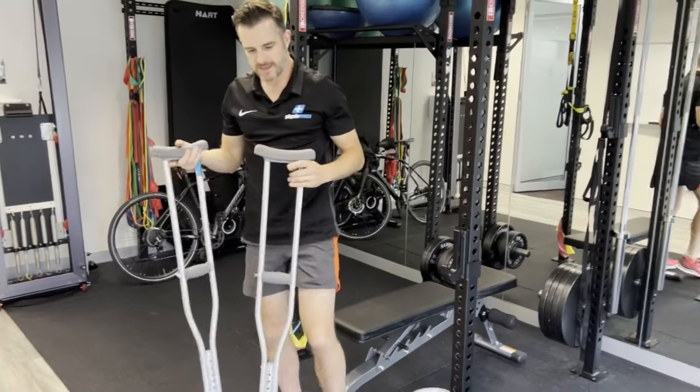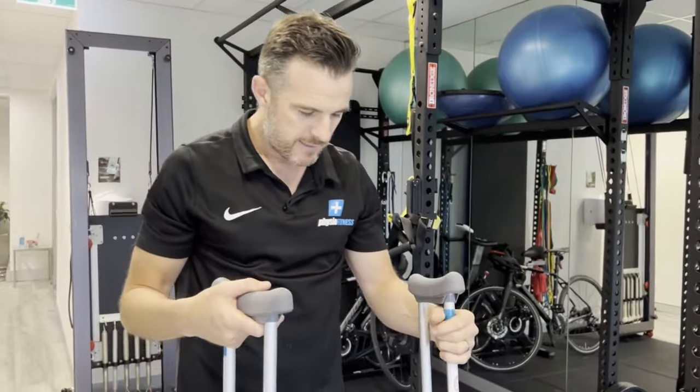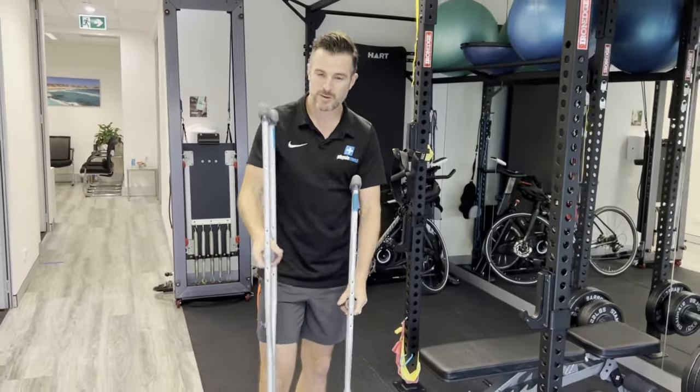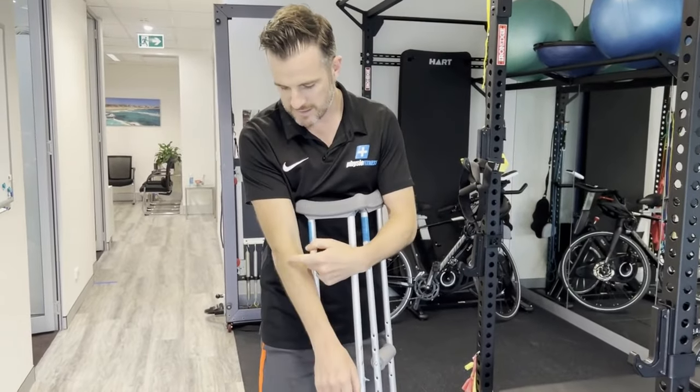A little tip about the crutches — these are armpit crutches. There are also elbow crutches. Initially when you injured yourself, you need the full support and stability, so you're probably going to be on the armpit ones, and then maybe you'll move down to an elbow crutch.